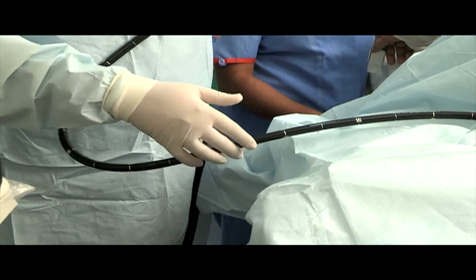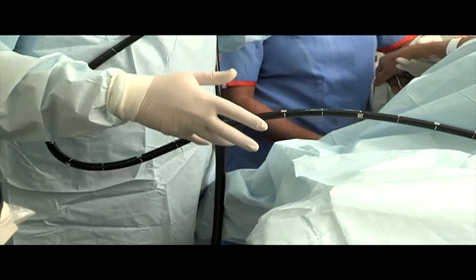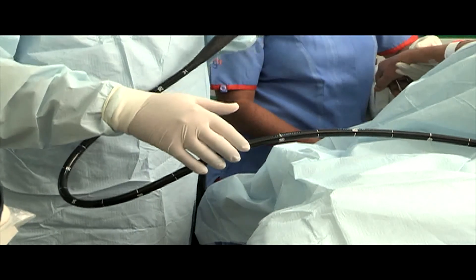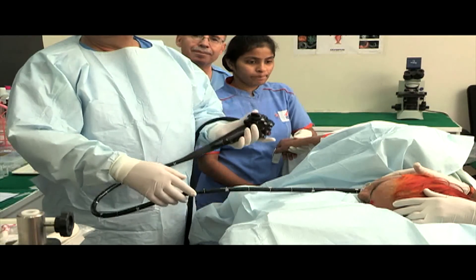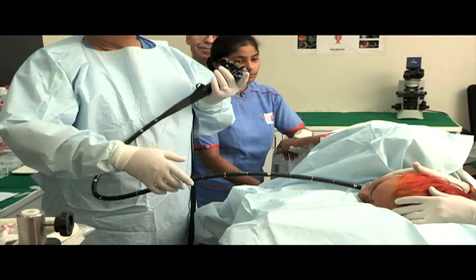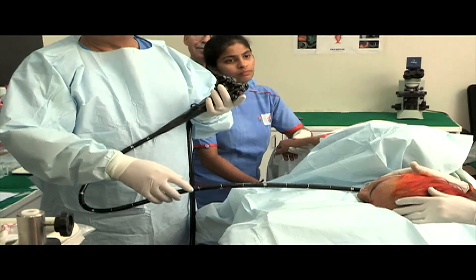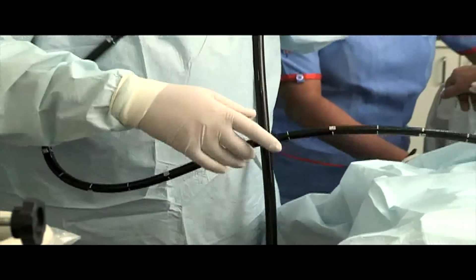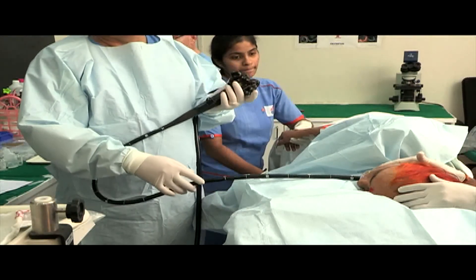The fingers of the right hand gently push the scope sideways and are used as a fulcrum so that the shaft of the scope can rotate over them — much like how you use your fingers to play the guitar; it should be soft and gentle. The left hand holds the control section, which literally rests over the left hand. The right hand controls the shaft farther from the patient's mouth. Torque or rotatory movements are produced by rotating the left hand and using the right hand as a fulcrum.